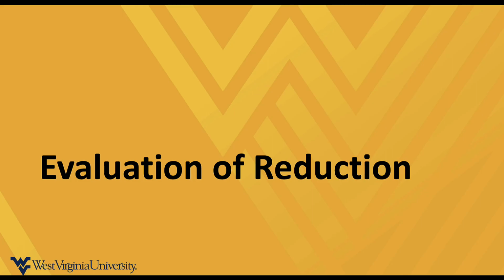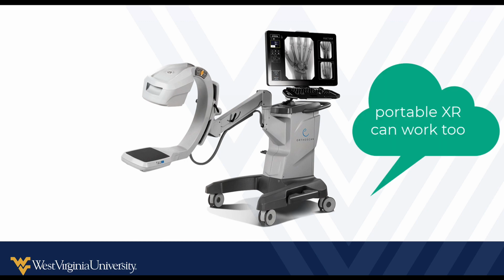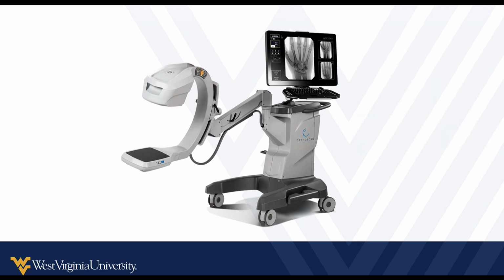Now again, we talked about evaluating the reduction. Not everybody has this, but if you do have it, and sometimes you have to ask, does somebody have one of these in the operating room of our hospital? And they may have it, and it's not widely known, or it doesn't sit in your emergency department. But these are more available than you probably realize that they are. And I like these. They're useful, especially once the splint is on, because you can't really do point-of-care ultrasound through the splint. But if you want to look at your reduction after the splint is on and make modifications in your mold, these are nice for that. Obviously a luxury.